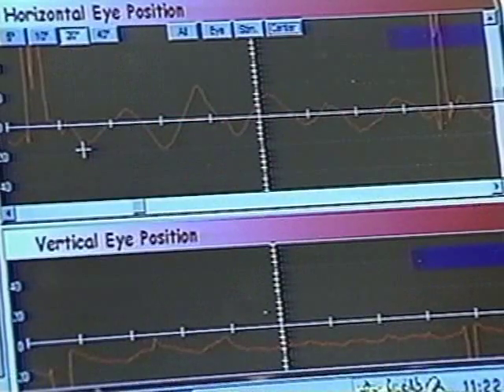In the case of the torsion swing testing, the patient's head is held in an immobilized position while the patient's body is rotated from side to side. In this particular test, nystagmus can be induced and is normal. The absence of nystagmus is abnormal. Additionally, once the fixation light has been turned on, it is expected to see a 50% or greater reduction in the degree of nystagmus.